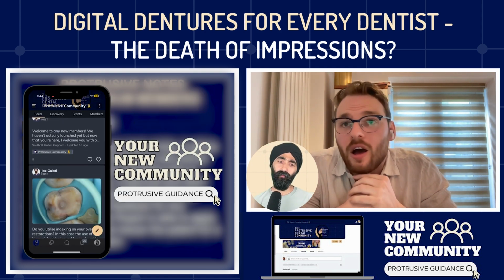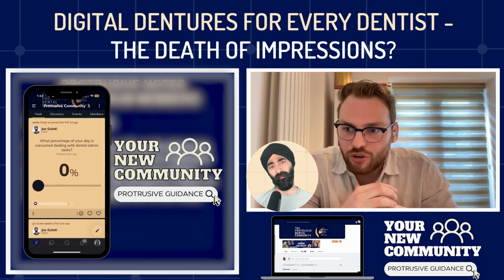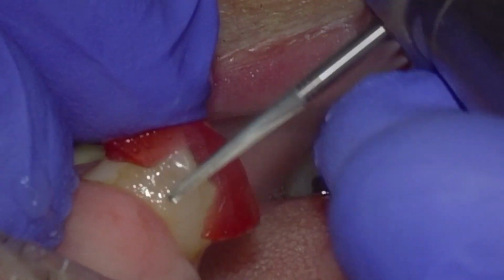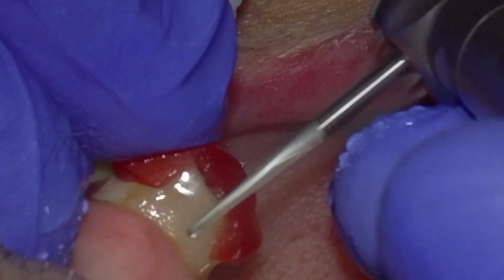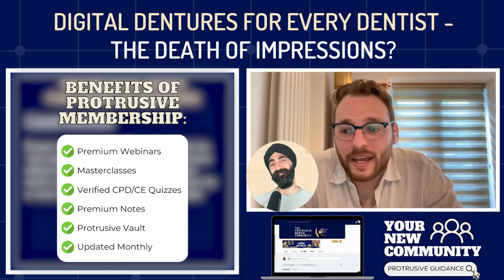Bit of both, yeah. Eyeballing it usually, but if it's particularly tricky, you can have some crazy ones where you've got a lateral and a 7 and that's your sort of bounded area. That's quite hard to line up. If you've got a 5 missing and you've got a 4 and a 6, it's like a bridge prep. It's quite easy to line those up. But yeah, copings are great.